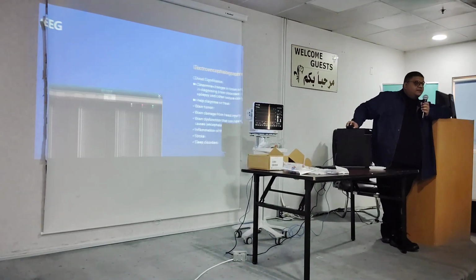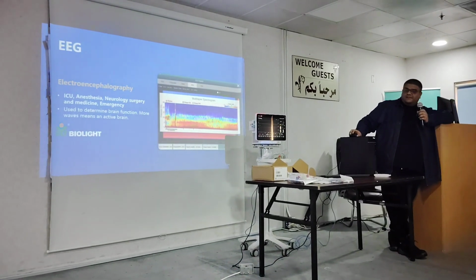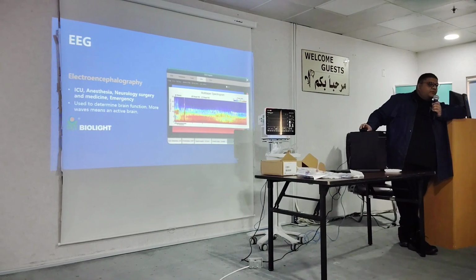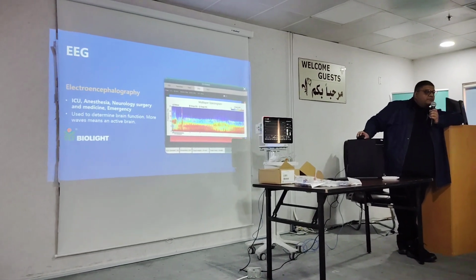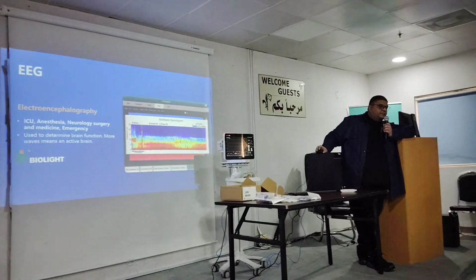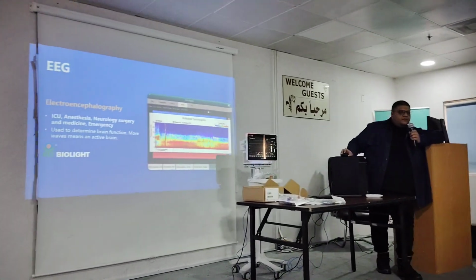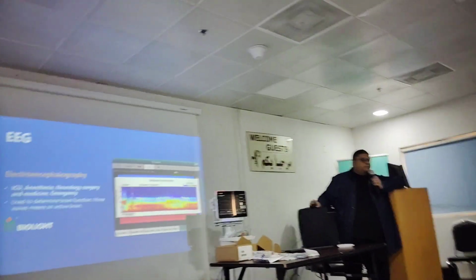During the EEG procedure, they are blinking a light at the eyes of the patient. So what type of waves are they using for that? They're not using waves. We're detecting waves, monitoring. We are monitoring all 4 of them, and we will see what the patient is experiencing. That procedure with the strong blinking light is to detect seizures in a patient.